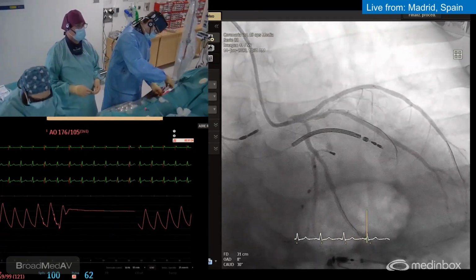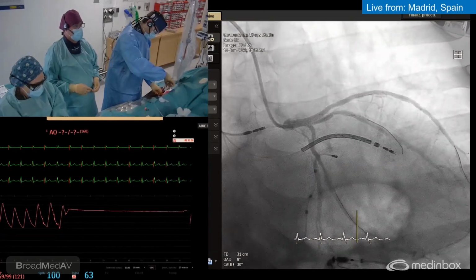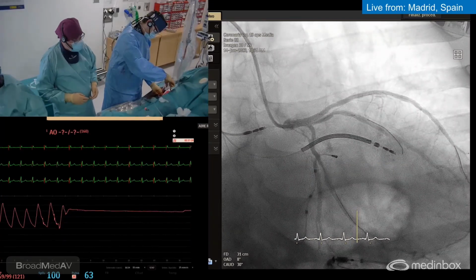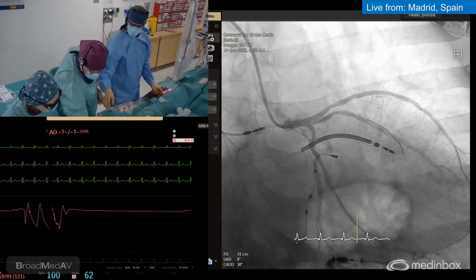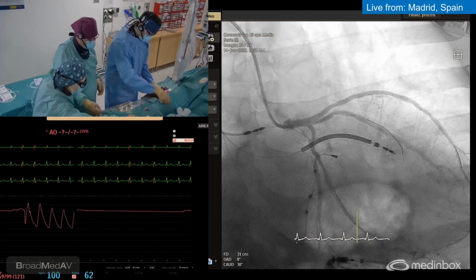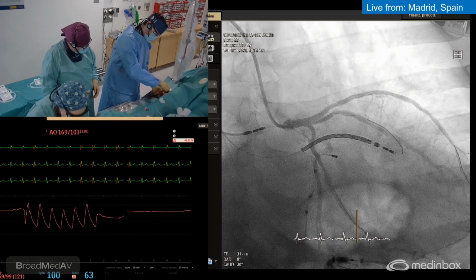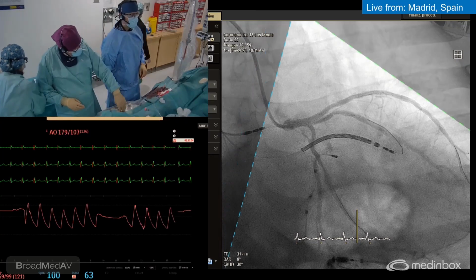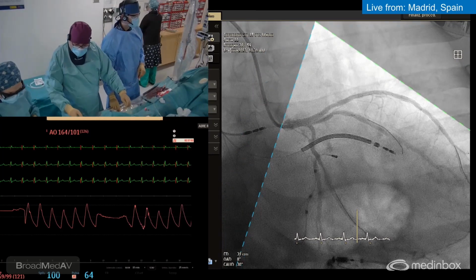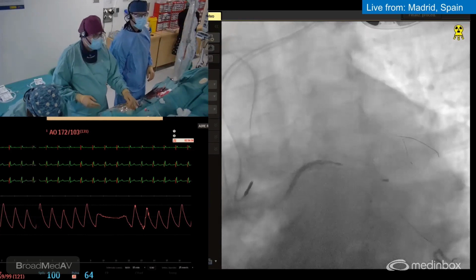We are checking again and again the heparin. I think the angio is perfect. Now we are going to see the IVUS, and the IVUS will tell the truth. Okay. No question, Danny? No question. Okay. Let's do the spider. Blood pressure is perfect.